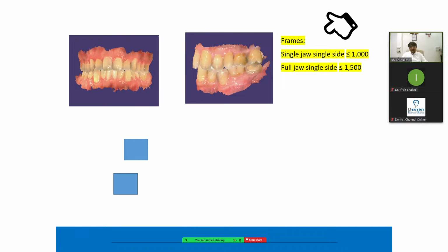It is not like you invest the money once and the same scanner goes for a lifetime. The scanner also has a life. Any gadget has its life. For example, you have a mobile. The mobile also has its life. More than that it will not work, even though it is working well. Your software is upgrading, so it will not support your mobile. In the same way, the scanner also has its life.